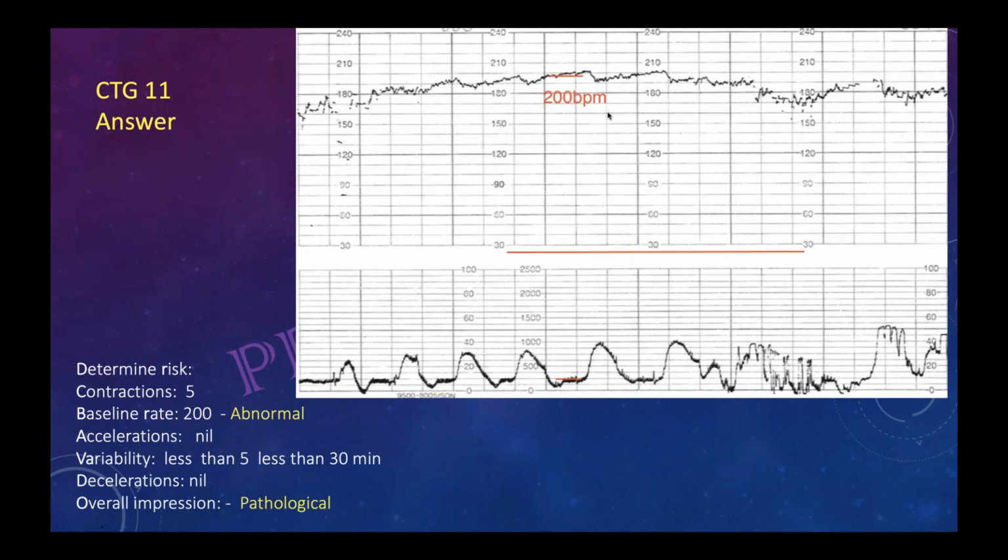In that situation you can put it also, but if you have already put the trace under the pathological category, then your treatment will be in the pathological category. The category will not change.